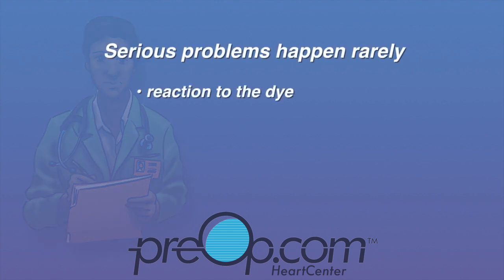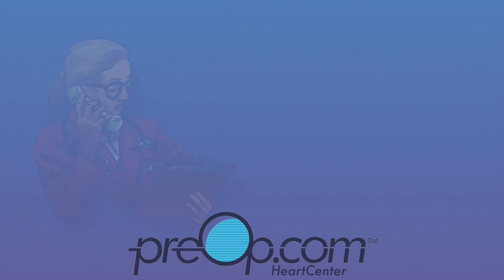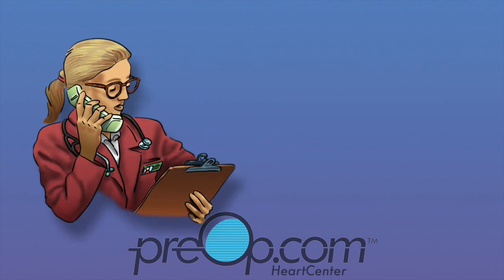There is a risk of having a reaction to the dye, bleeding, damage to an artery or the heart, stroke, heart attack, and even death. That is why you are monitored closely during and after the procedure. You can help by telling the staff about any problems you are having.